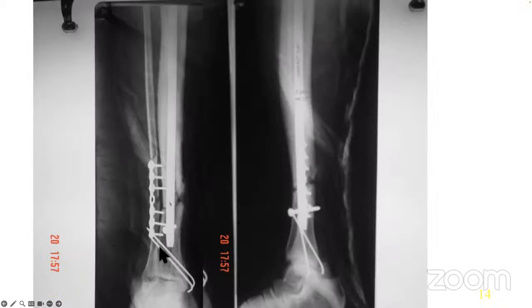Or now you can see here, even if you dynamize, this will not work because these wires will come in the way. Obviously, this is not a good nailing because there are only two screws down below; one screw should have gone all the way down. That's the reason why this is a bad nailing. There is a defect here, and he has tried to put in the medial malleolus screw. So this will not allow dynamization, even if you want to do it.